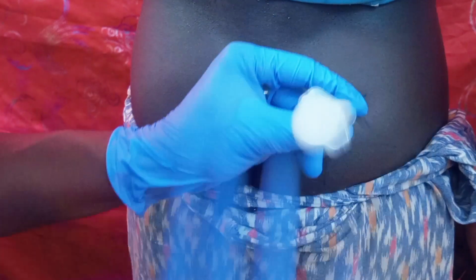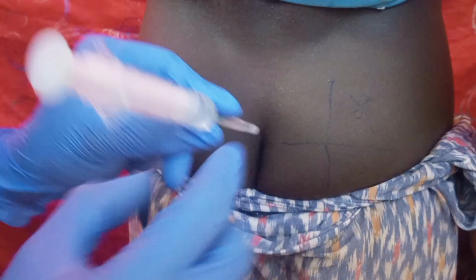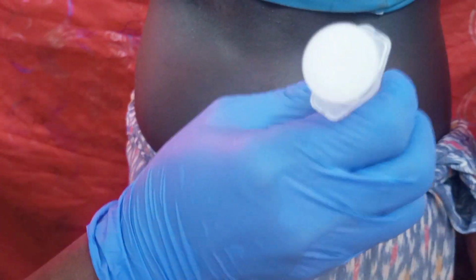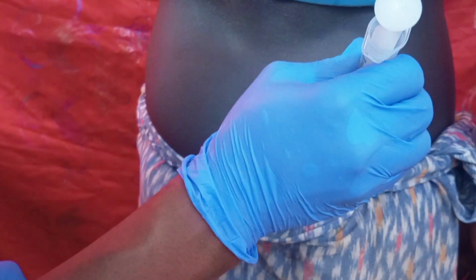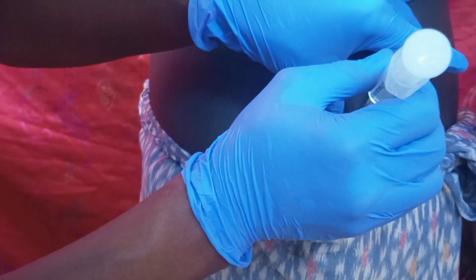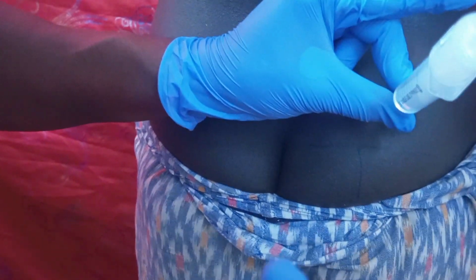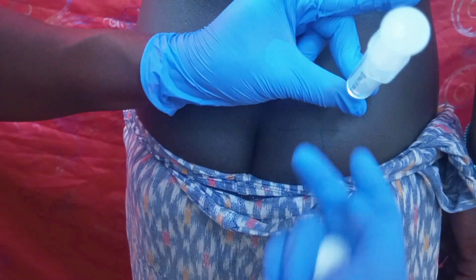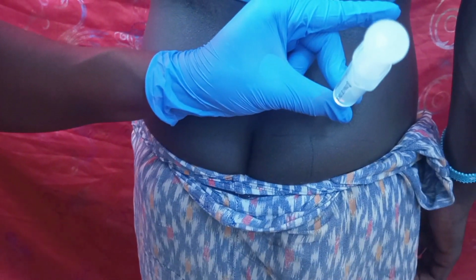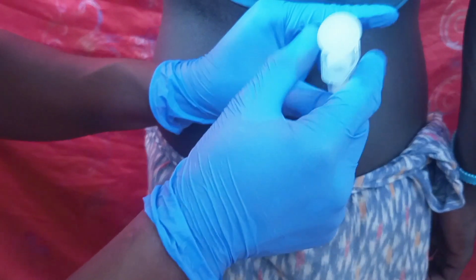Then you apply a cotton wool on the area where you have given the shot. So let me repeat the procedure. You hold the needle at a 90-degree angle deep into the muscle. First you grab the skin like this, you insert the needle 90-degree angle deep into the muscle, then you hold the cap of the needle, you release the skin, you aspirate, you pull back the plunger to ensure if there is blood. If there is no blood, you can give the injection safely. If there is blood, you pull back, you remove the needle, and you start a fresh injection. So this is how you are going to give intramuscular injection, especially the gluteal muscle.